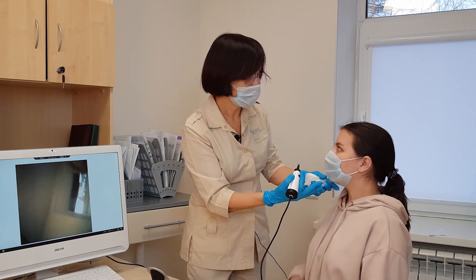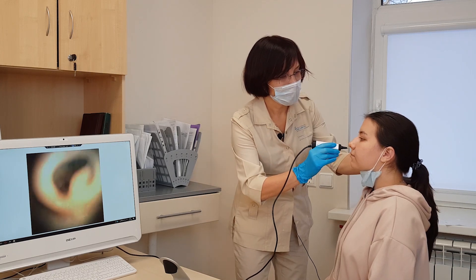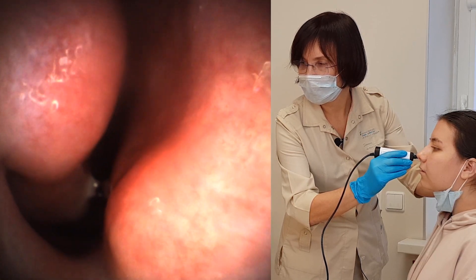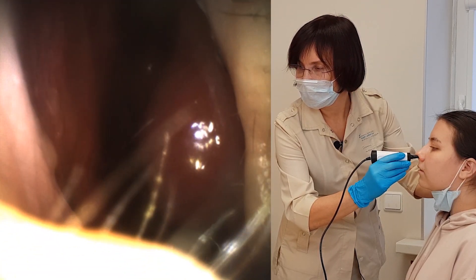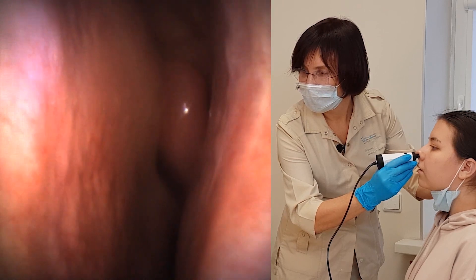Please put away your mask. We can see the nose. We put the endoscope into the nose and see the septum and turbinates, and then from the other side also we see the septum and turbinates.